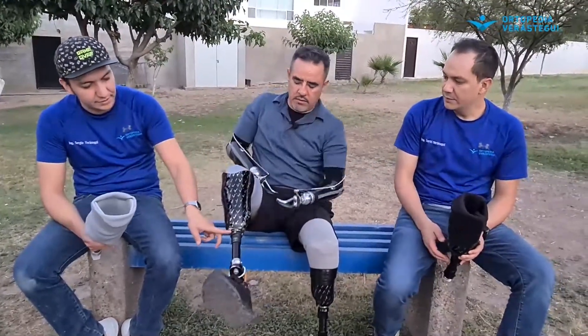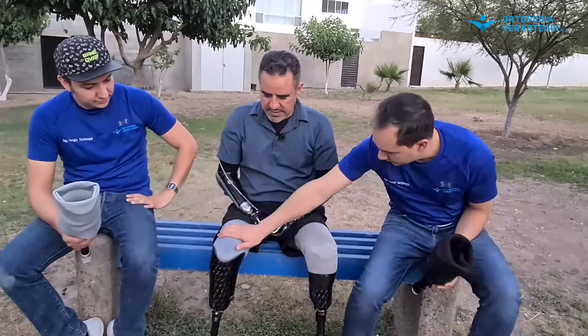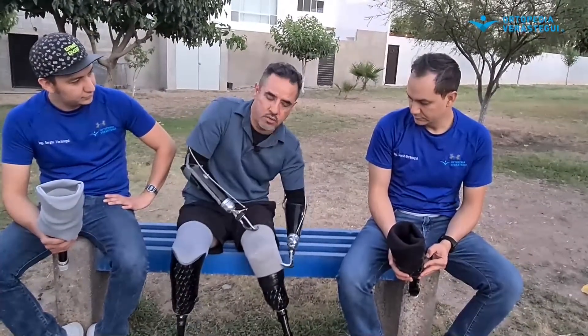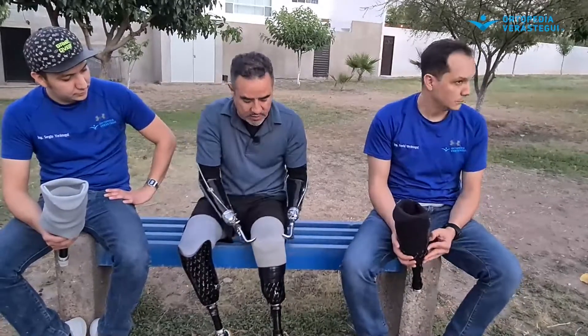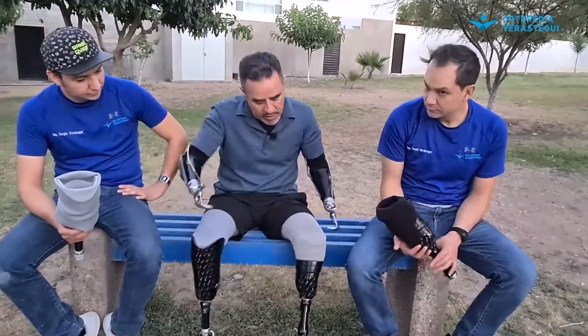Esa es una diferencia. La otra diferencia es muy visual: rodillera afuera versus rodillera adentro. Para mí como usuario es una ventaja tremenda, porque estás en el socket duro sobre fibra de carbono y la rodillera de silicón topas con algo rígido y la puedes cortar fácilmente. Aquí no — es una gran diferencia, le puedes topar como sea, no hay bronca. Aparte a la hora de doblar te da un ángulo mayor.